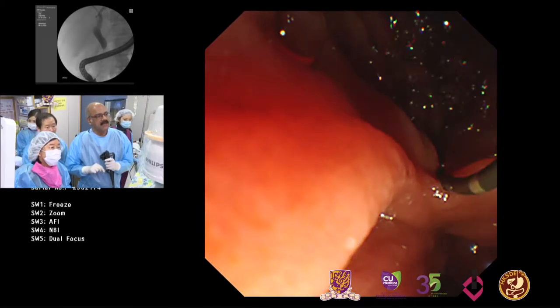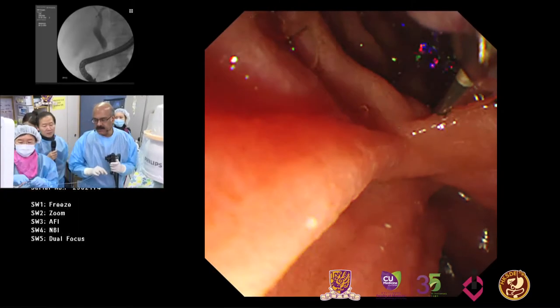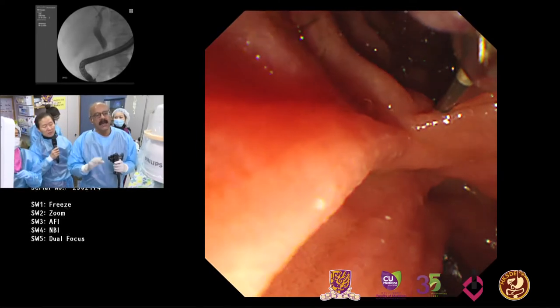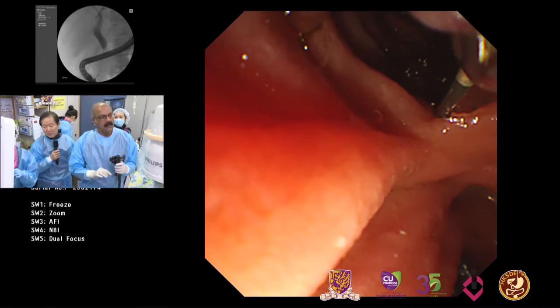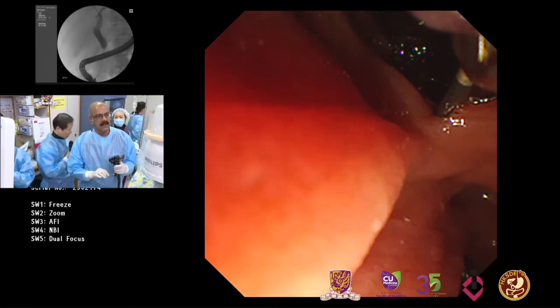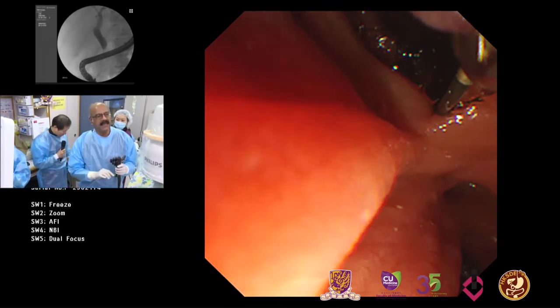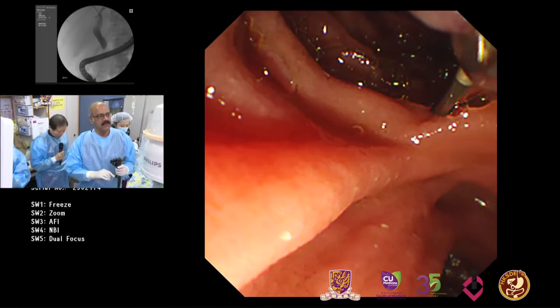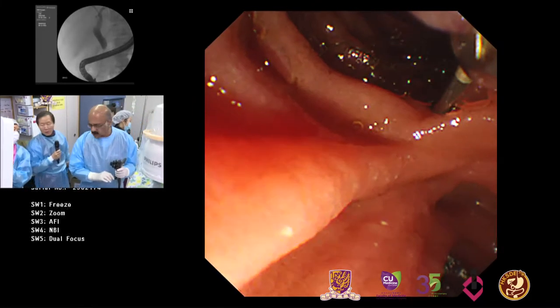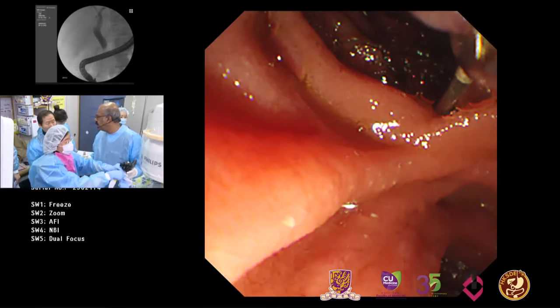So now what I'm going to do is leave the wire in place. And you can see, as she pushes the wire, I'm pulling out. And then I'm now going to select a radio frequency ablation catheter to ablate this tumor. Now, there are two companies, but I prefer to use the StarMed, the Korean company, which has very good electrodes. There are two sizes of electrodes available. 1.8, which gives an injury of about 2 centimeter length, and 3.3, which gives an injury of 3.5 centimeters. So in this case, I generally prefer to use 1.8, but it's a very long stricture, so maybe we have to do it several times.